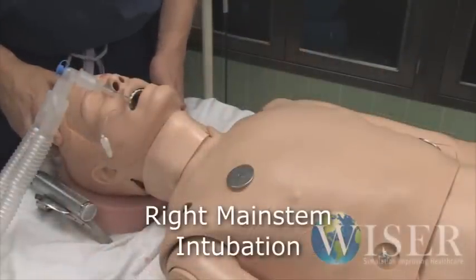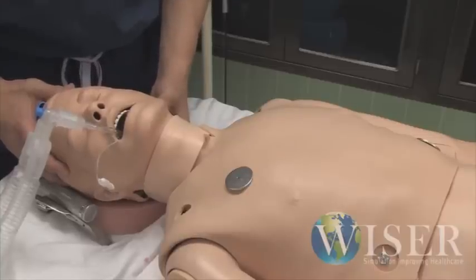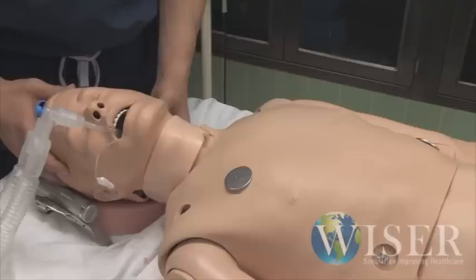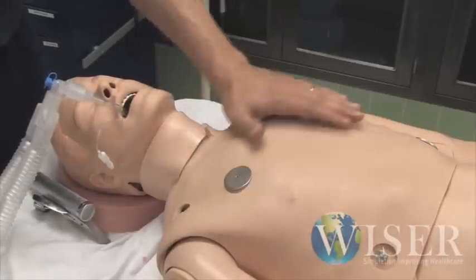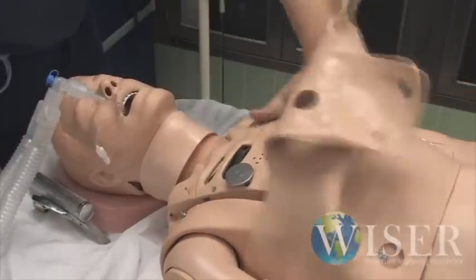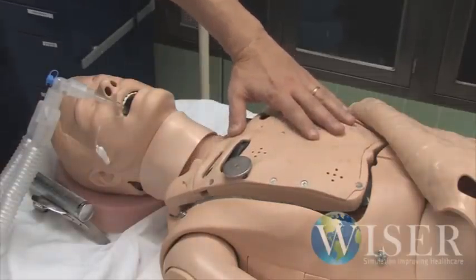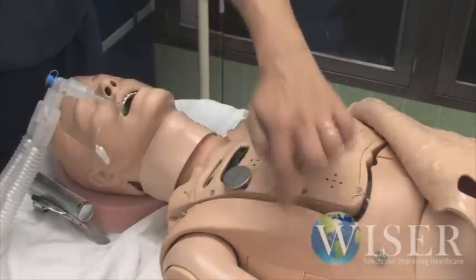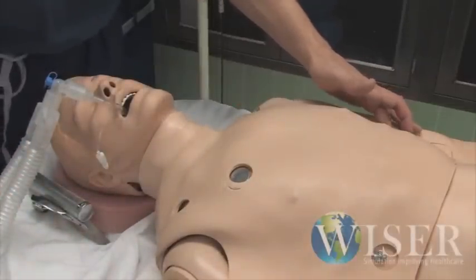This is an example of a right main stem intubation in our simulated patient — you can see the endotracheal tube is quite deep. The usual depth for a mid-tracheal intubation is correct in this mannequin; 21 or 22 centimeters at the teeth usually equals a mid-tracheal intubation. Anything much deeper than that and you'll probably be in the right main stem bronchus. These mannequins have one solid plate across their chest, so even when the right lung goes up the left one will come up a little with it. However, you'd only hear breath sounds in the right lung speakers, not the left — so that's how you identify a right main stem intubation.